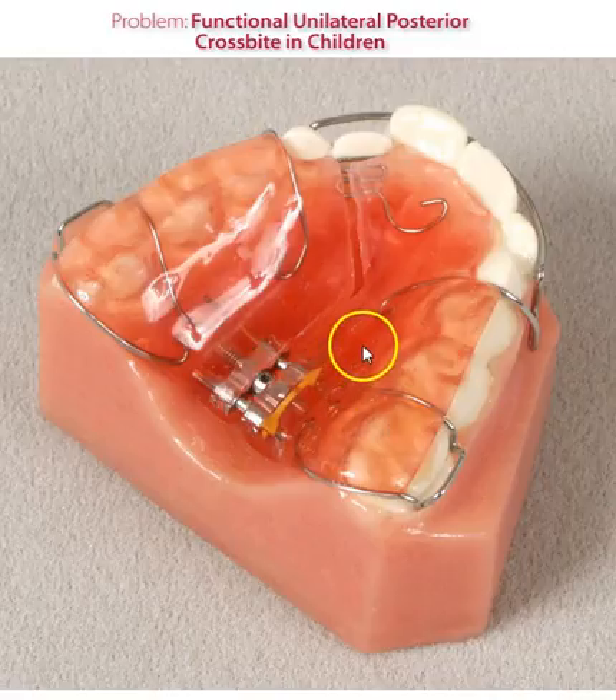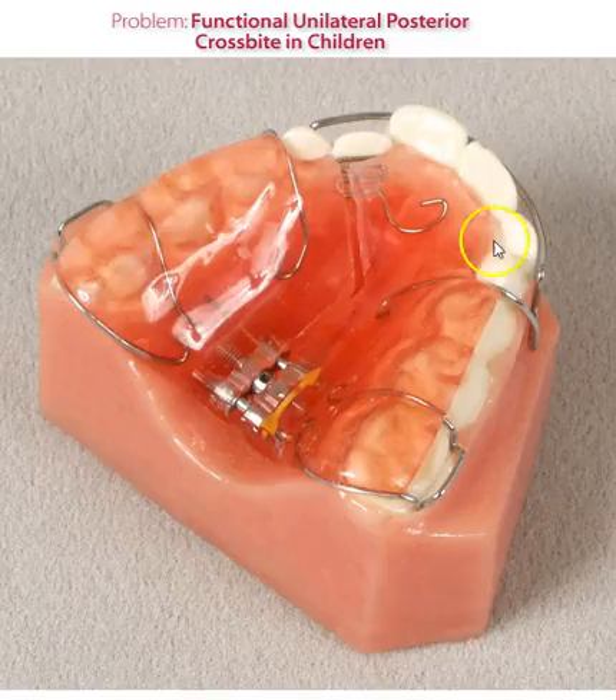This appliance is traditionally worn 24 hours a day. The gear is activated once every two to three days, and many doctors will instruct the patient to wear the appliance while eating. There are benefits to eating with the appliance — it generates good forces, but secondly, if the patient takes it out during eating, they may undo what you're doing in the active phase.